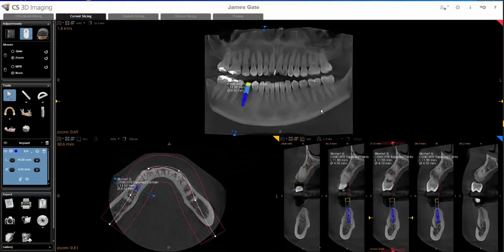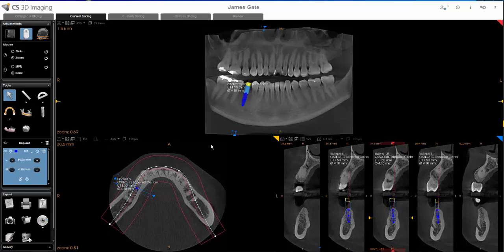During the consult appointment, you'll work up your surgical plan in the 3D software and save it. But oftentimes I see clients opening this scan back up in the 3D software the day of the surgery — we don't necessarily have to do that.